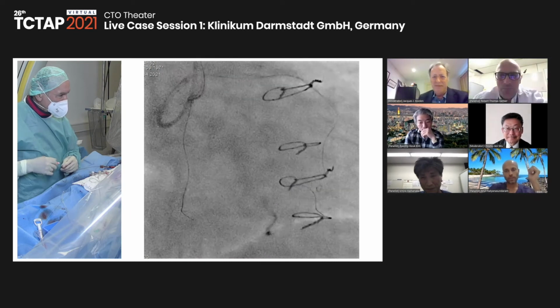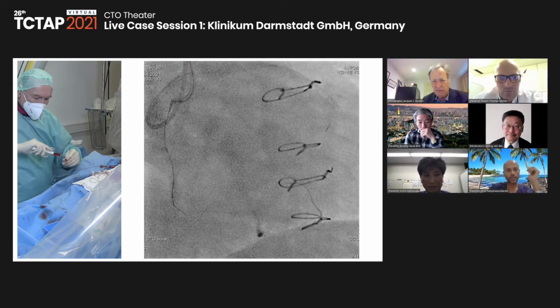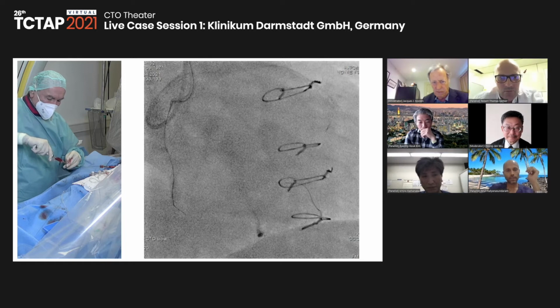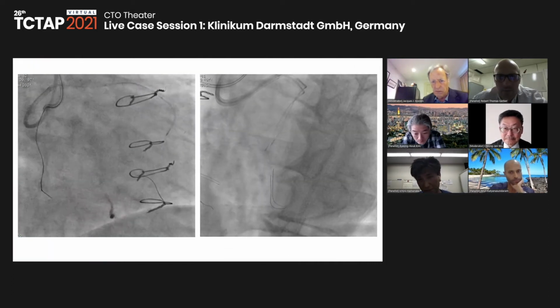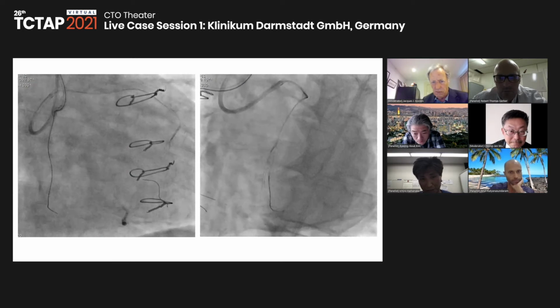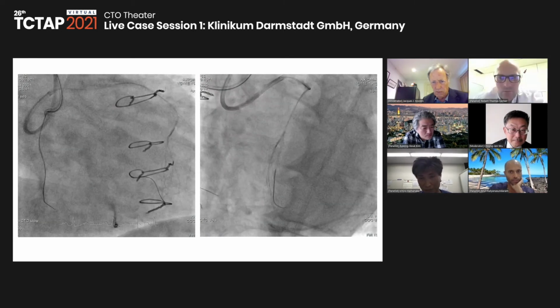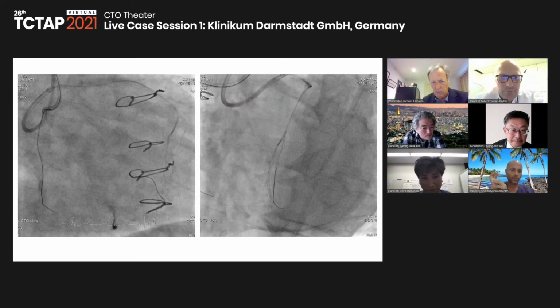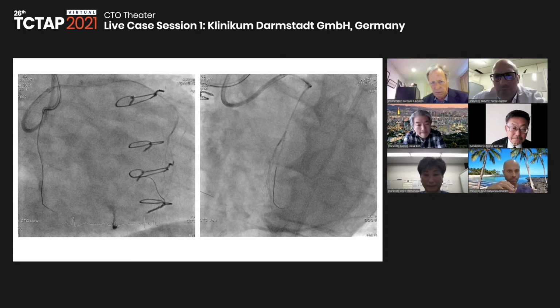So, yeah, I will make an injection again here. A and B, please. And Gerald, would you consider surfing on the other septals at this point if you're not making progress? Yes, I will definitely. There are some other options here, maybe. Maybe I take one of the other branches. I'll switch back to the Sion because the Suoh didn't help me here.